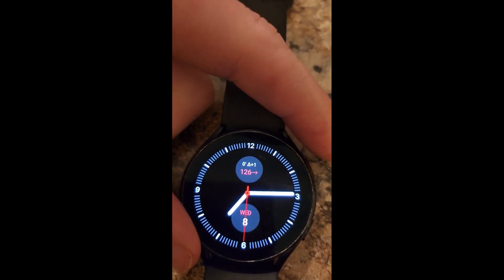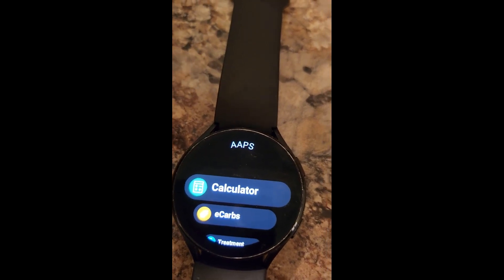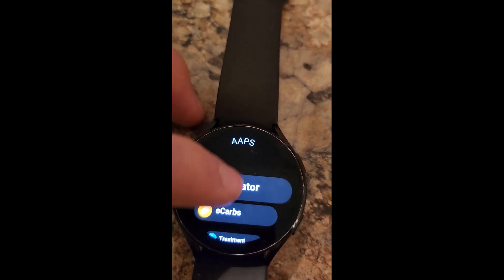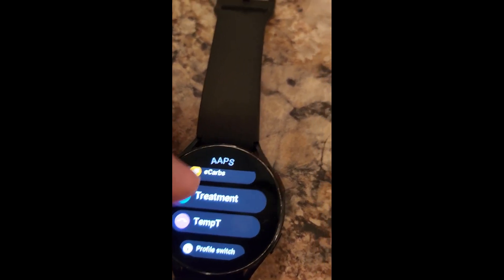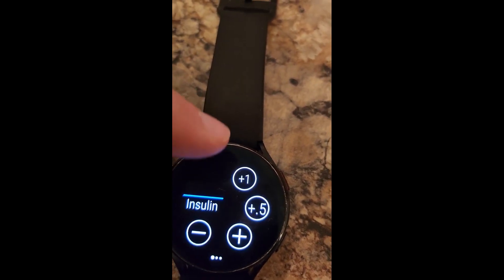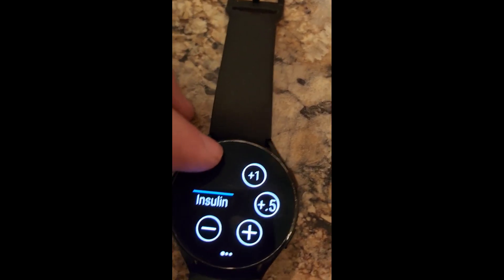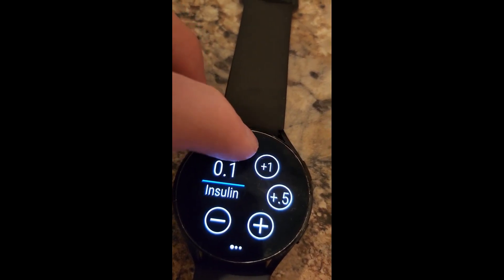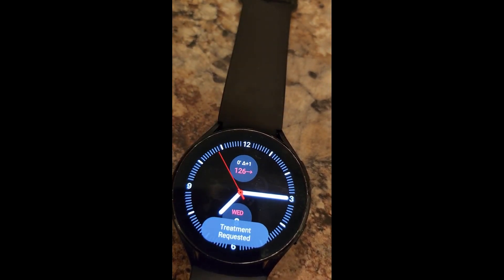What I did is set up a double click paired with Android APS, and you get the calculator — you can set a temp target. I'll give myself just like a 0.1 unit so that you can use the virtual crown, which is pretty cool, and then boom — treatment requested.